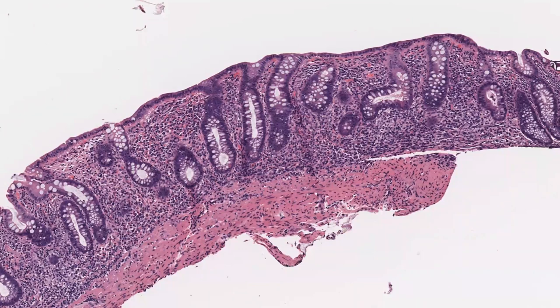So this is my answer to you. What are you going to do with this biopsy? And this is the ultimate problem, that a lot of people don't know what to say. And some of you said, well, I was waiting for you. I was waiting for those who would like to call it IBD, right? For clinical pathological correlation, right? So I was eagerly waiting for this step to happen. And this is exactly what some of us will do, right?